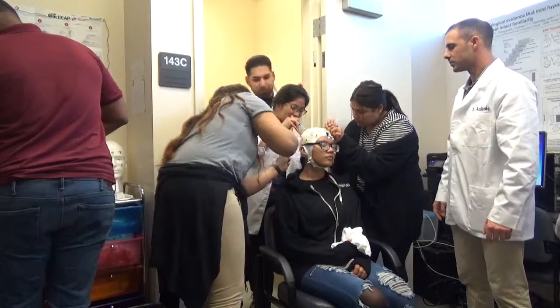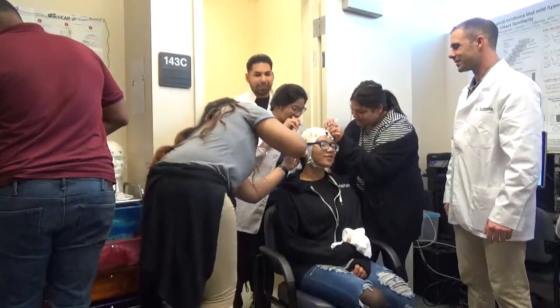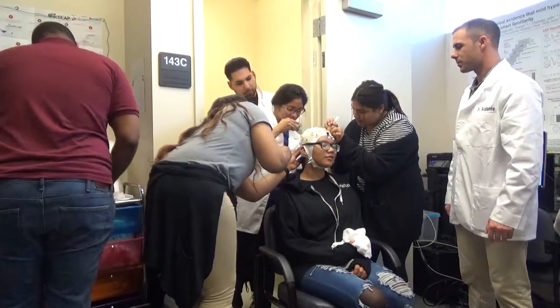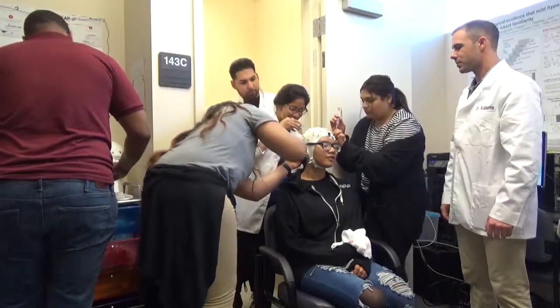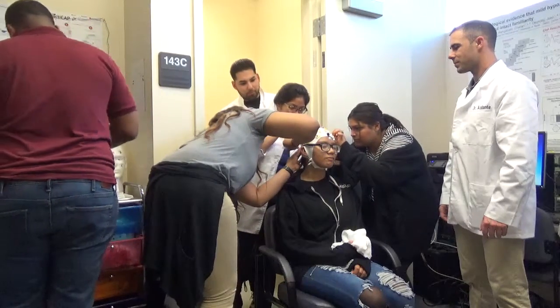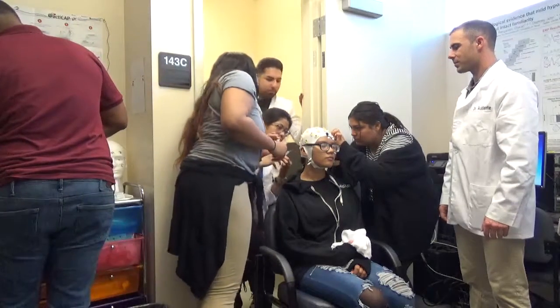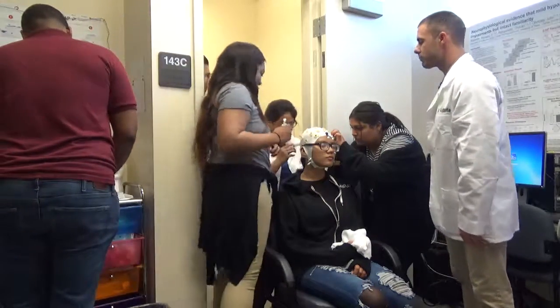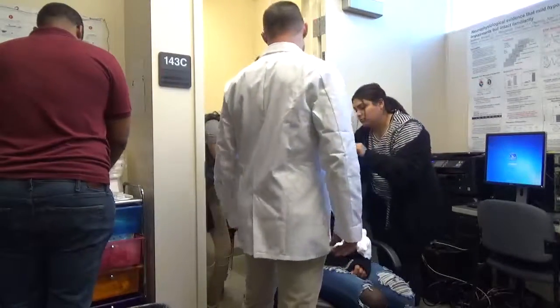Are you enjoying the massage? I don't really like massages, but I'm feeling just okay. Just kidding. It's fine. As long as you don't feel anything. Don't be scared. I'm not fragile. I don't think they need my help anymore. Yeah, they got it covered.